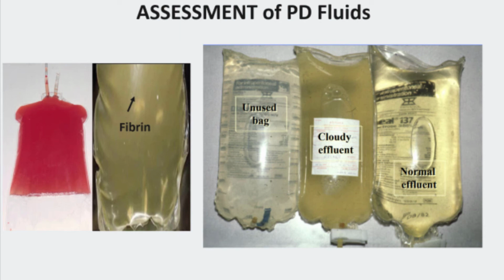patient. While you do not have to set up the patient or disconnect, cloudy fluid is much like a patient spiking a fever. If you notice your PD patient has cloudy fluid, please page the dialysis nurse and let her know. The bloody bag is from a patient with hemorrhagic pancreatitis, where a proteolytic pancreatic enzyme causes the destruction of red blood cells. Women who are menstruating may also have bloody fluid like this picture.